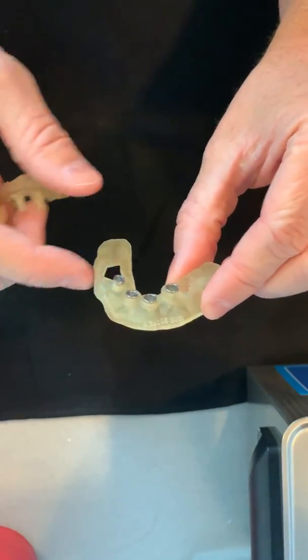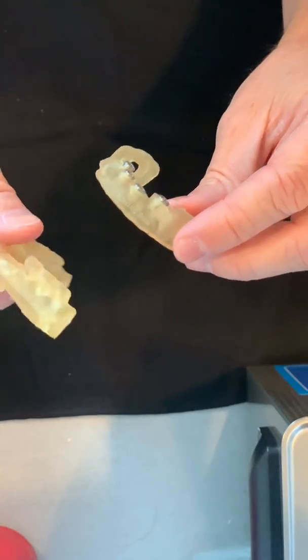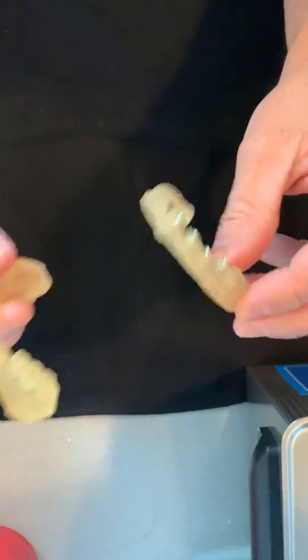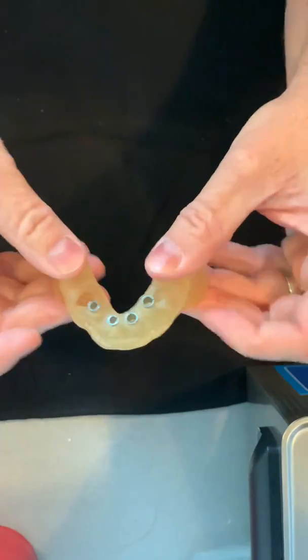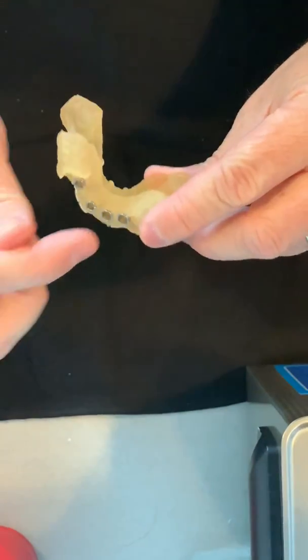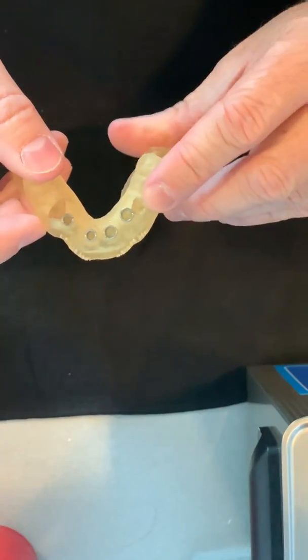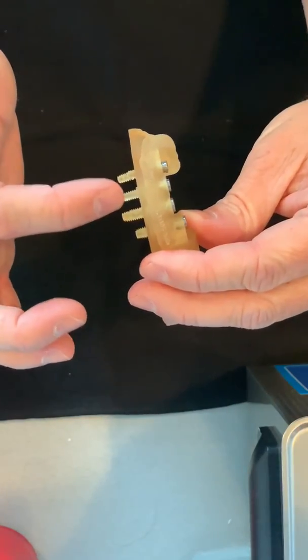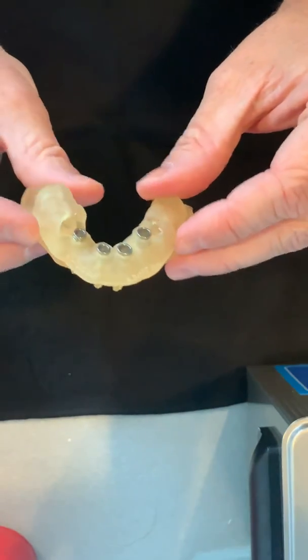This is based on where we had teeth designed digitally. It just snaps on the teeth like that. Everything is already pre-planned — exactly where to go, the position, the depth, and everything — which will place the implants in the perfect position.